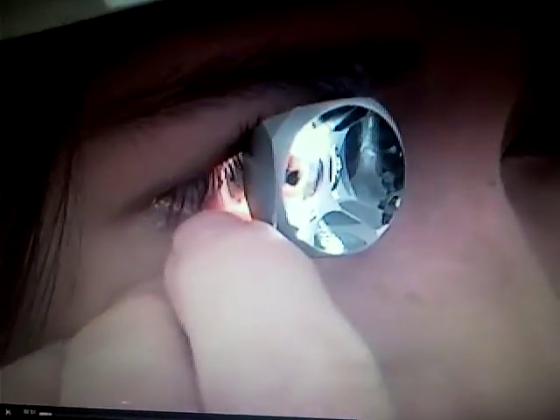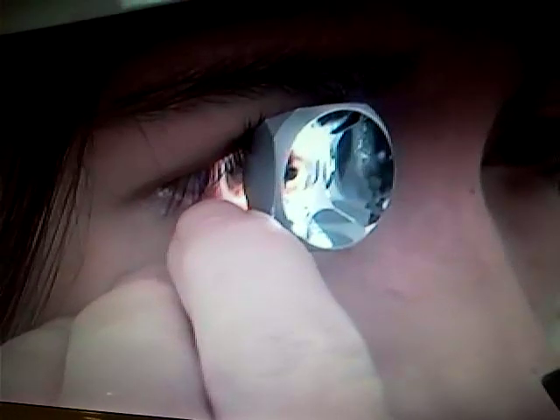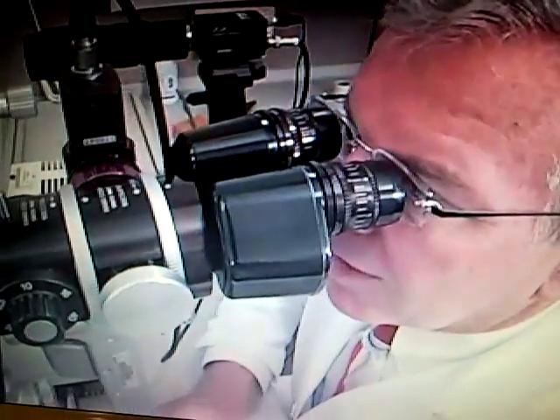This sequence will show general exam techniques. We'll then have separate clips to show specific techniques for the four mirror lens and the three mirror lens.